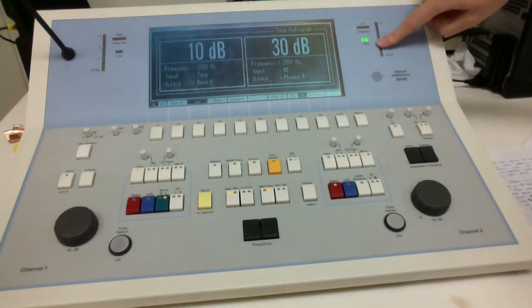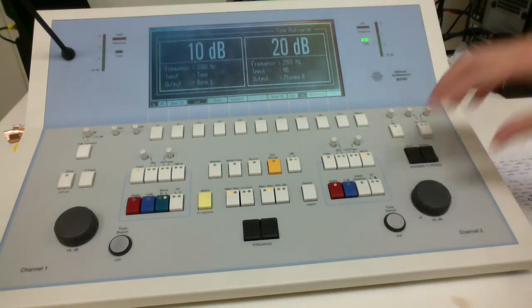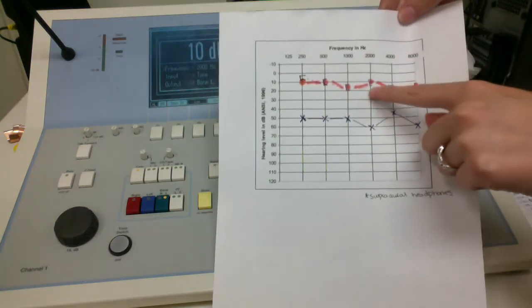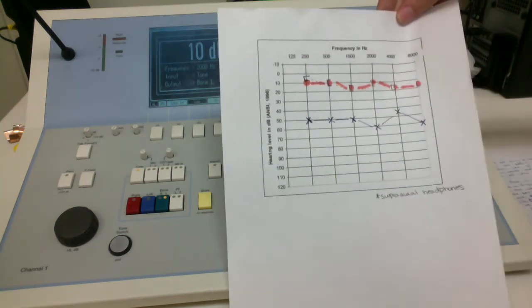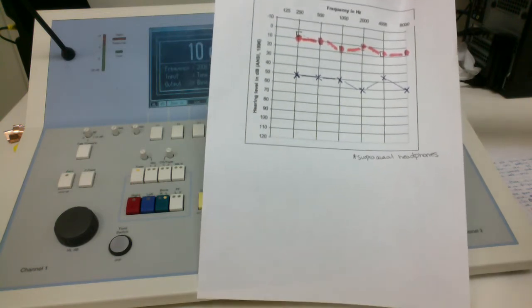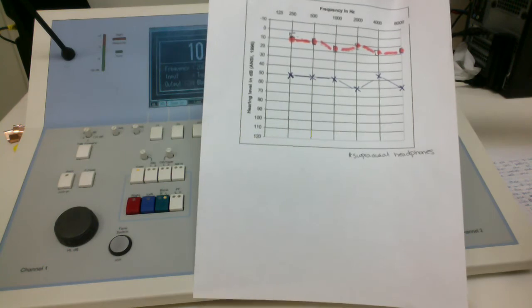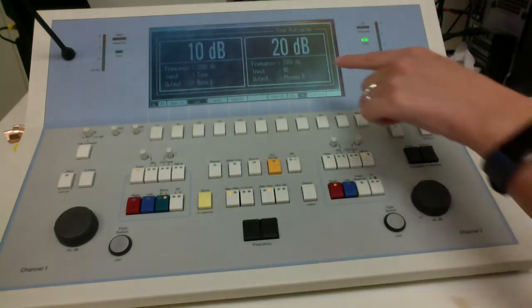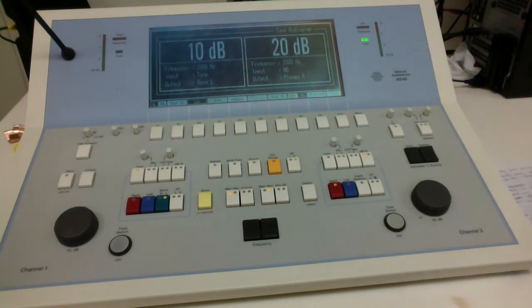It's presented continuously, and we're going to be setting it at the level of 20 dB, since 10 dB was the bone conduction threshold right there, and we add 10 for effective masking. We don't need to add more than 10 because we aren't worried about the occlusion effect at 2000 hertz. And that masking noise, like I said, should be continuous, which it is.